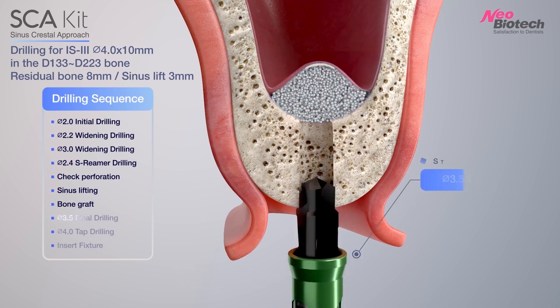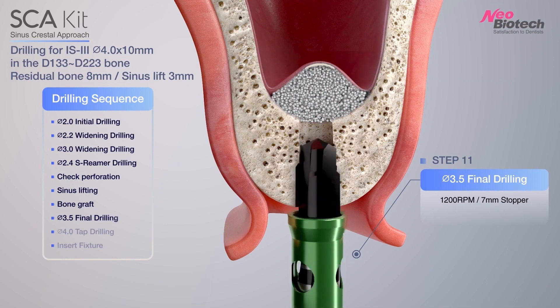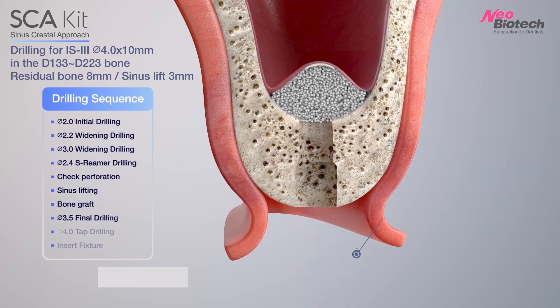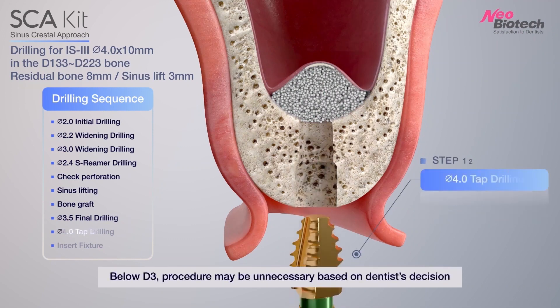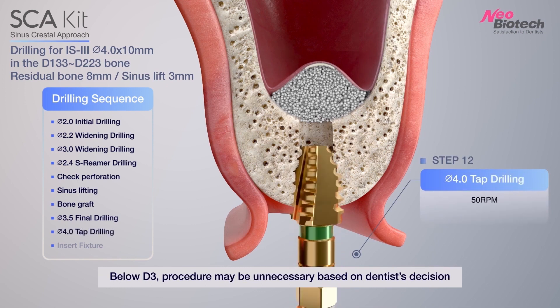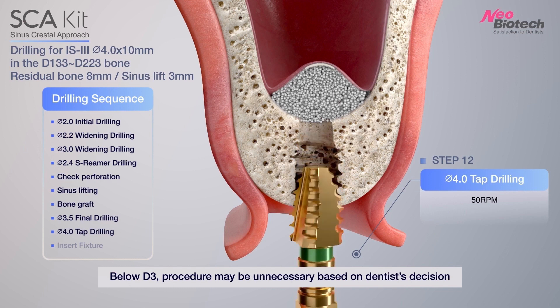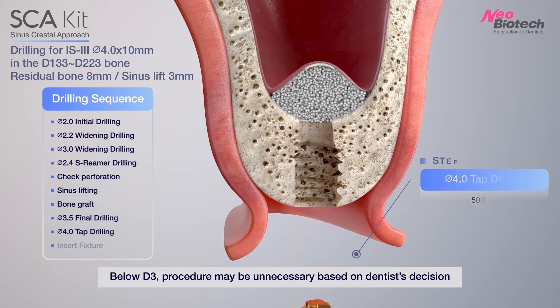Final drilling with 3.5 mm drill in surgical kit. When bone is hard like D1 or D2, tapping the Crestal Cortical Area with tap drill. But below D3, this procedure may be unnecessary based on the dentist's decision.